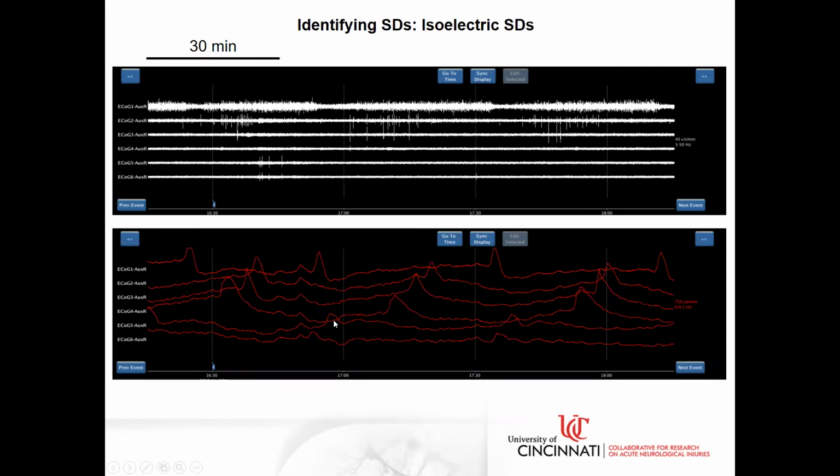So we can see here, for instance, this wave starts in channel 5 and propagates to 4, 3, 2, 1, and then the same pattern repeats again, 5, 4, 3, 2, 1. And so again, just to emphasize, spreading depolarization can occur without spreading depression if there's no spontaneous activity in the tissue. And that further reinforces why it's really important not to use these terms synonymously.